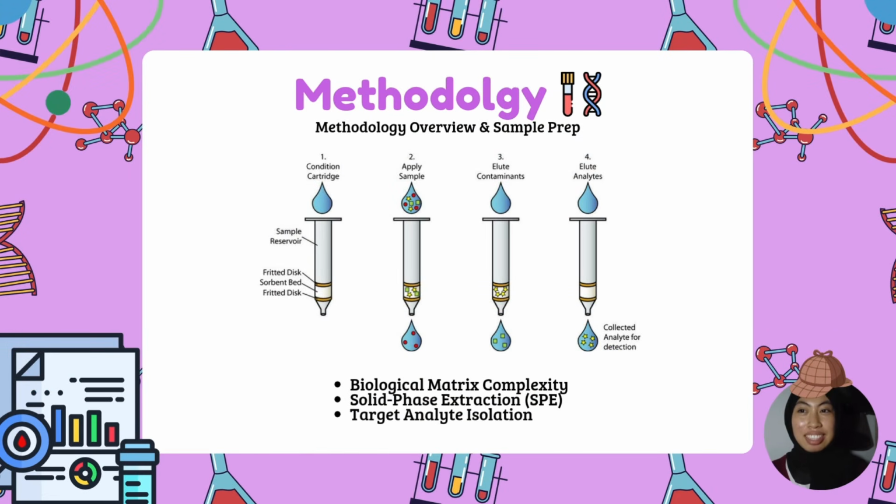When a forensic scientist gets a raw blood or urine sample, we can't just inject it straight into our instruments. The proteins and fats will instantly ruin the system. So step 1 is the chemical cleanup called solid phase extraction (SPE), which you can see on the slide.